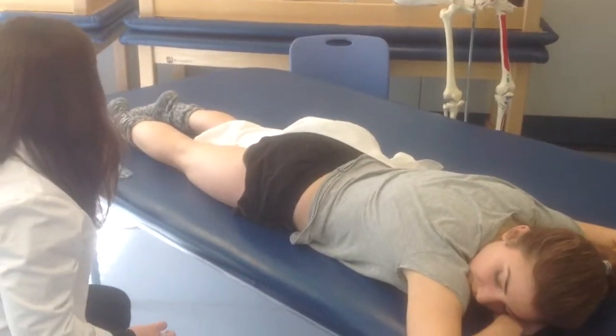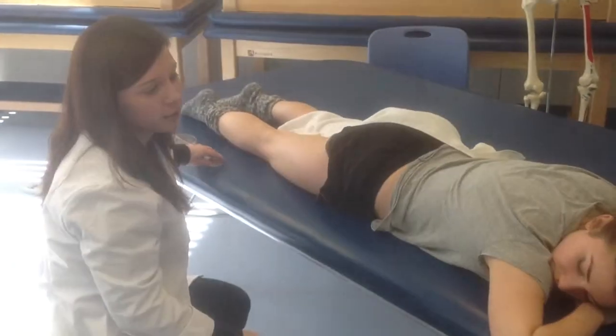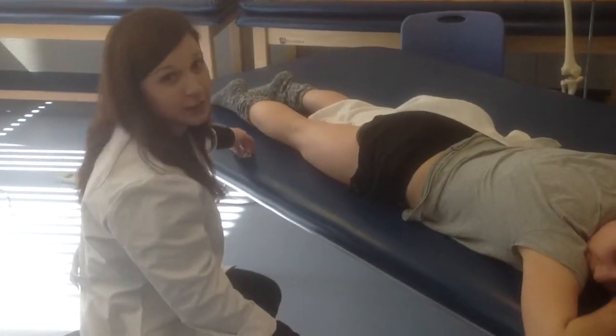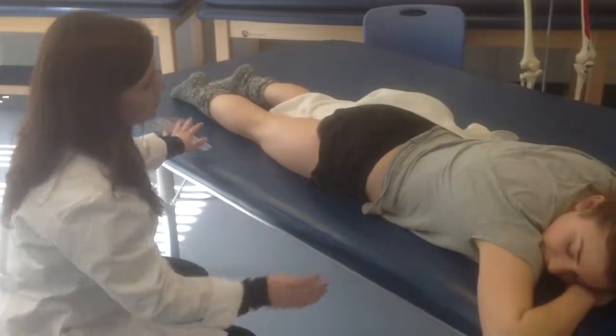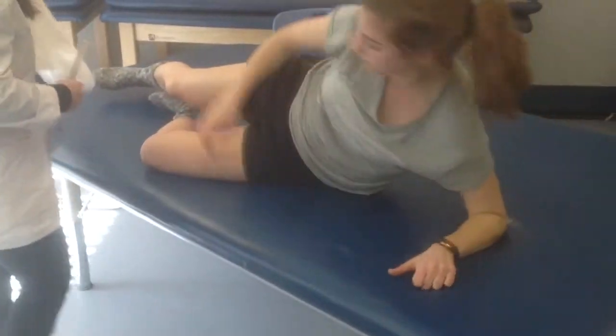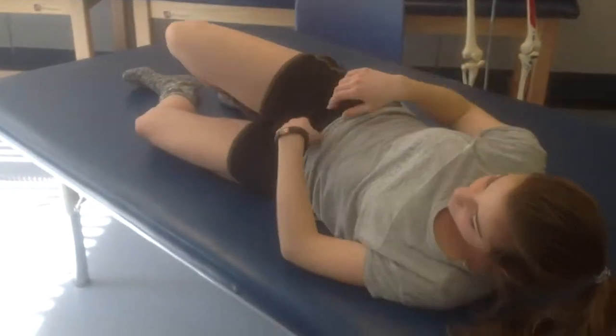For her passive range of motion, I'm going to put her into sidelying for ease of maneuvering and to make it easier on my arms. Ms. Corbin, can I have you lie on your left side, please? An alternative method for hip extension goniometry is to have the patient in sidelying.